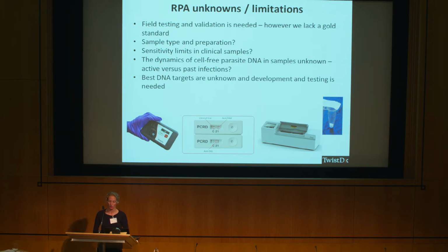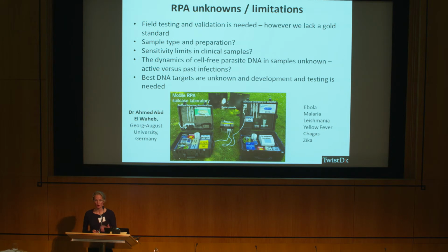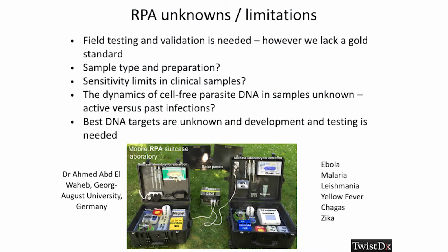We need to look at what the best DNA targets are and start screening many more molecular targets. This image was shown earlier as well. So Dr. Ahmed Wahab from Germany is developing these mobile RPA suitcases, and he's been taking them around and doing diagnostics of many pathogens now, again showing that this is portable and can be implemented in the field.